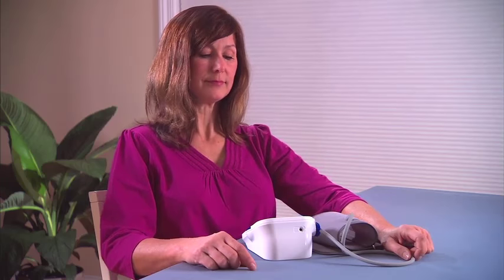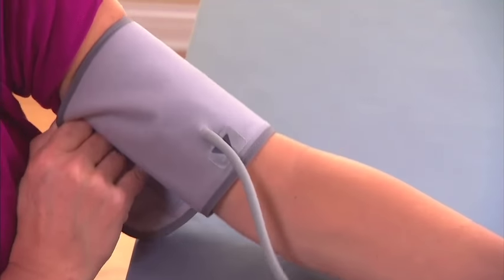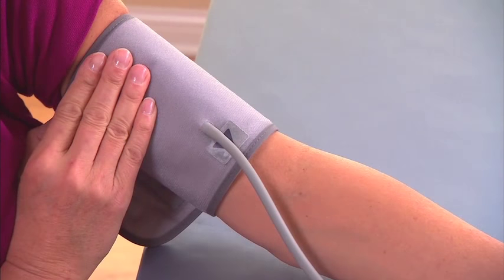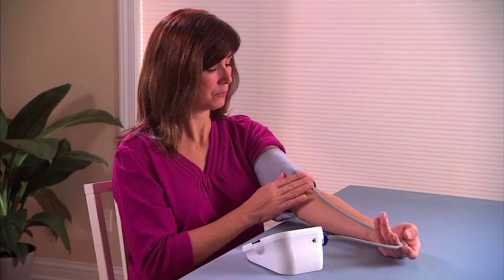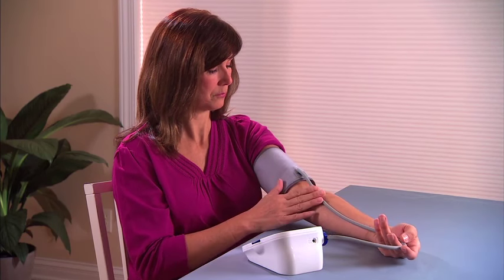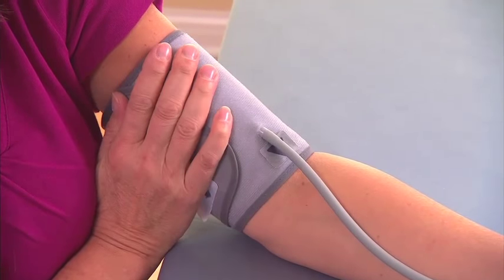Lean against the back of the chair. Stretch out your arm, palm upward. Place the cuff on your bare upper arm, 1 inch above the bend of your elbow. Make sure the tubing falls over the front center of your arm so the sensor is correctly placed. Pull the end of the cuff so that it's evenly tight around your arm.